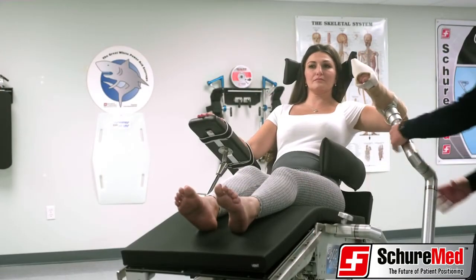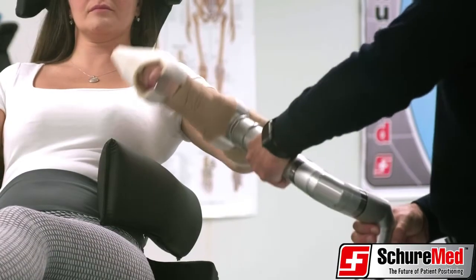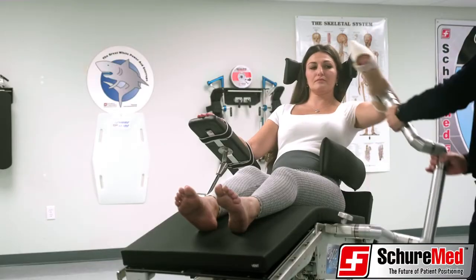The SureLock XPS has a single lever which releases all six joints so that the limb may be easily secured in an unlimited number of positions, relocking instantly when the lever is released.